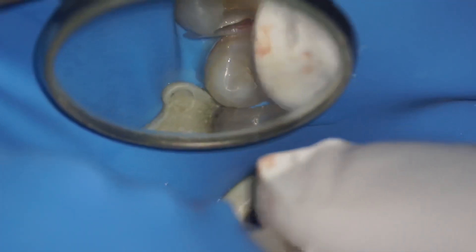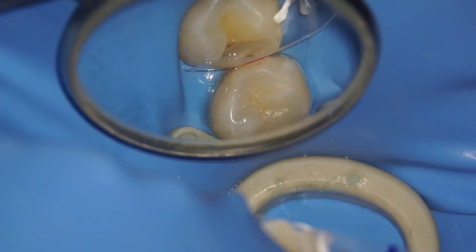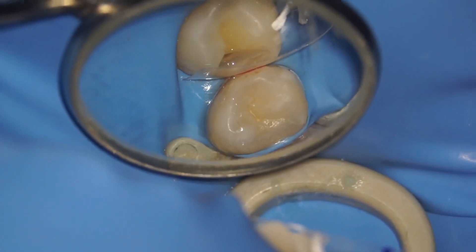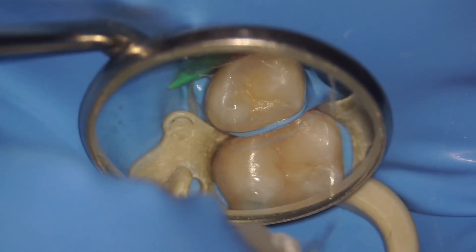For this case, I was considering using my normal saddle matrix or any other sectional matrix, but nothing seemed to fit perfectly as the 1,5 is slightly rotated. So I chose to use a clear matrix instead. This is me wedging the matrix — you can see it is leak-proof.